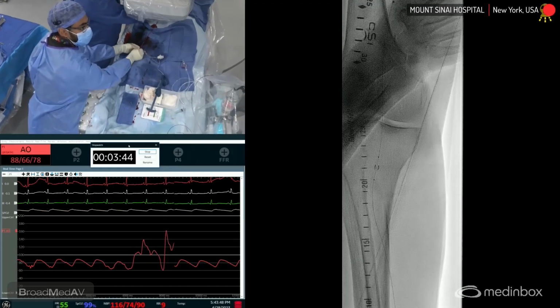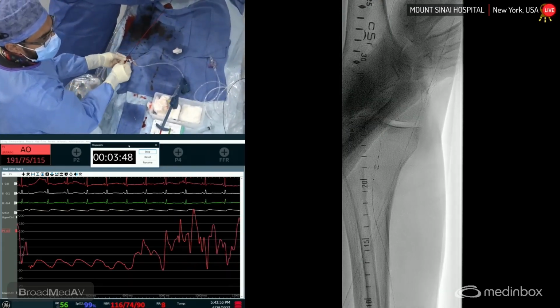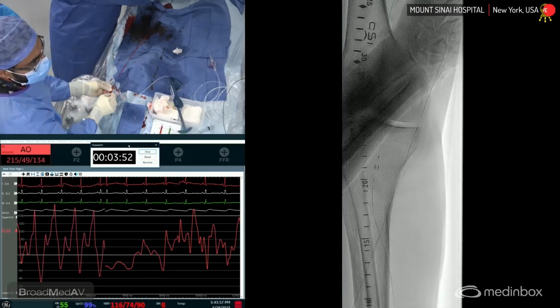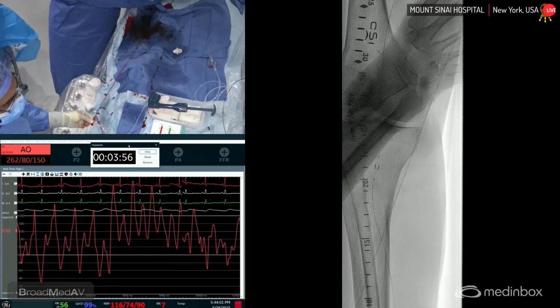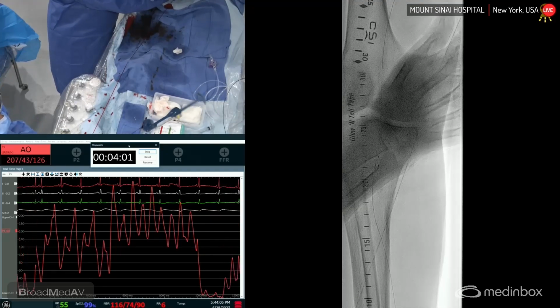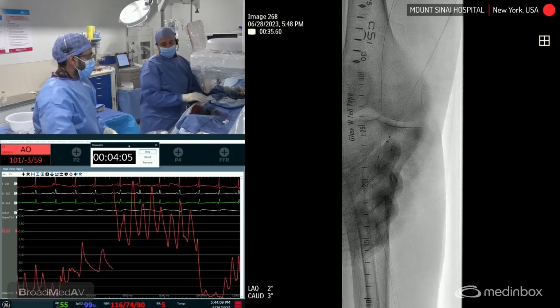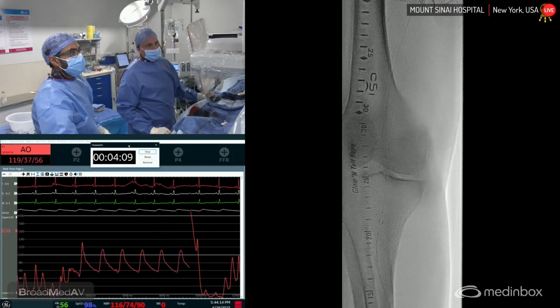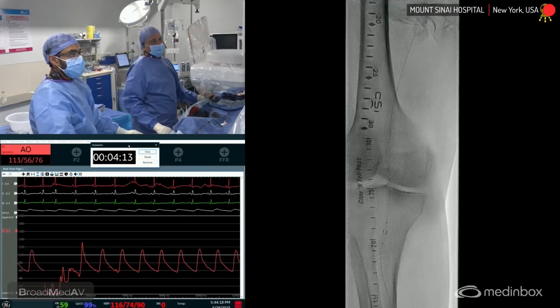I usually will assist Dr. Ibrahim by pulling on the balloon at the level of the sheath to prevent the sheath from also infolding, which can occur with these very large balloons. It's almost out. Notice we didn't touch our inflation device, to make sure it stays negative as we come out. Now we're just going to take some pictures and then decide what we want to do.